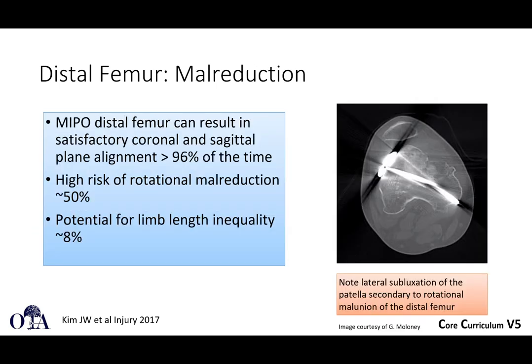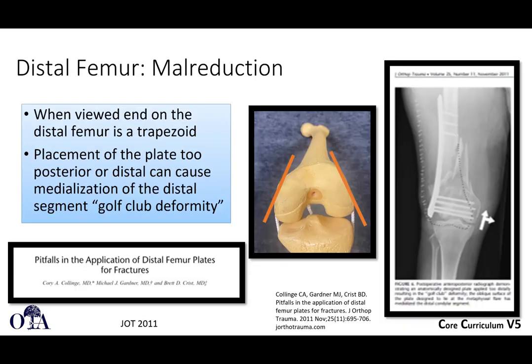On the medial side of the femur: minimally invasive plate osteosynthesis of the distal femur can result in satisfactory coronal and sagittal plane alignment most of the time, but there's a high risk of rotational mal-reduction — up to 50 percent as reported in the reference — and also potential for limb length inequality. A lot of this has to do with the minimally invasive nature; you're not seeing everything, so you have to be very cautious about overall alignment and reduction. Using bumps such as bumping up the hip can cause you to lose track of what your rotation should be.